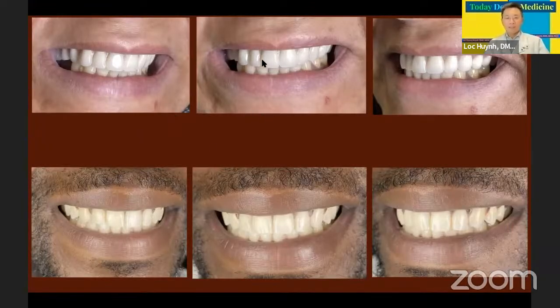Now, this is just for the dental assistant. When you take photos, make sure you have the consent form signed by the patient that allows you to use it for educational purposes or research. First shot right here. This is extraoral photo, right side, left side, and middle. Now the quality of these photos, top and bottom, you can see a big difference because of the lack of light on the bottom. The teeth look yellow.